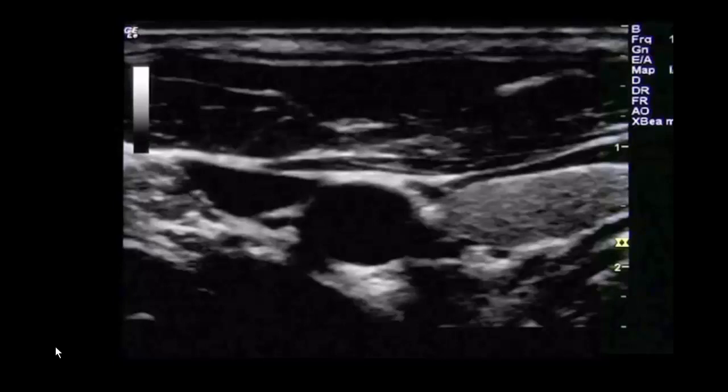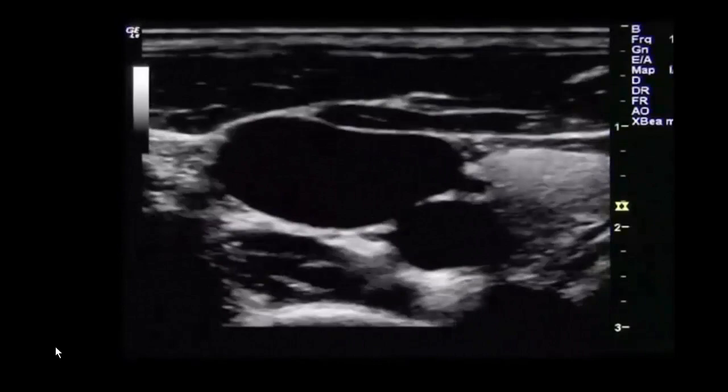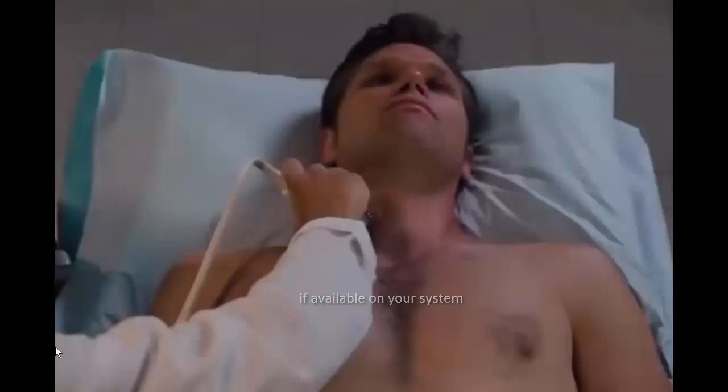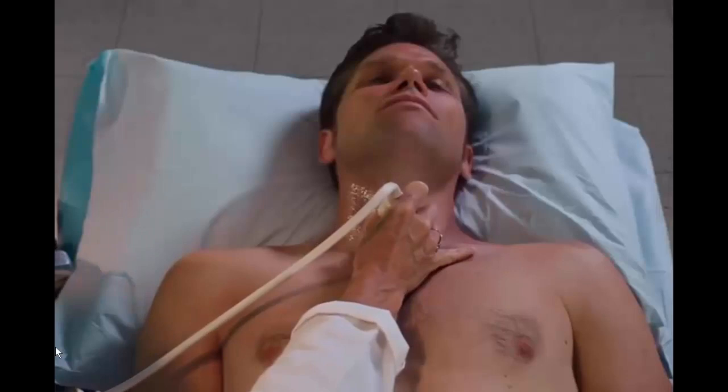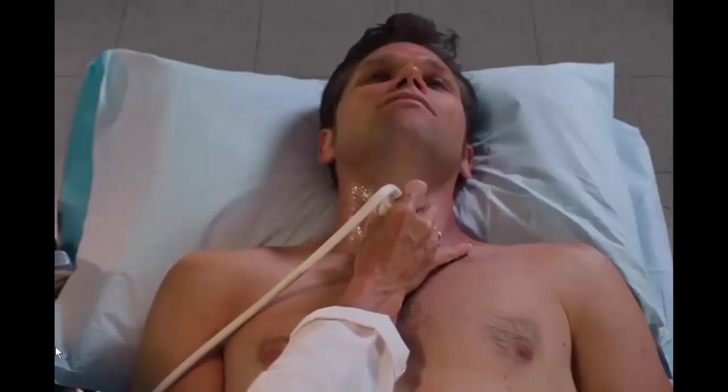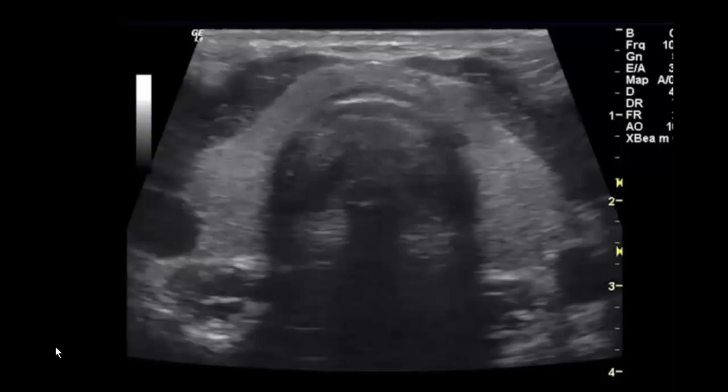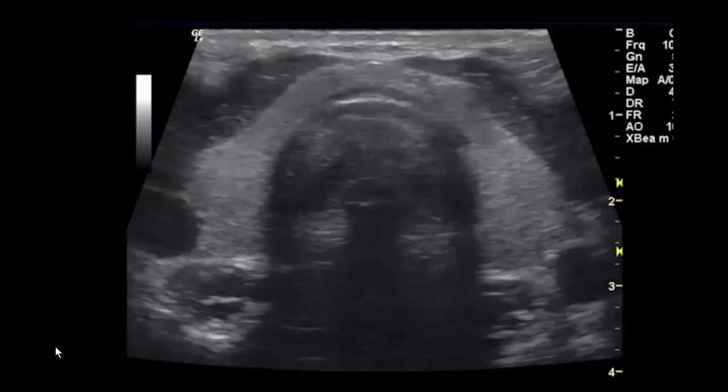Asking the patient to do a Valsalva maneuver will help distinguish the internal jugular vein by causing it to distend. Select the thyroid preset on the ultrasound device. To obtain a transverse view of the thyroid, make sure the probe marker is facing toward the patient's right. Place the probe on the anterior surface of the neck between the larynx and the suprasternal notch. Adjust the position so that the thyroid is in the center of the screen. Note the homogeneous echo texture of the normal thyroid gland. The thyroid is bordered anteriorly by the strap muscles and laterally by the carotid artery and sternocleidomastoid muscle.